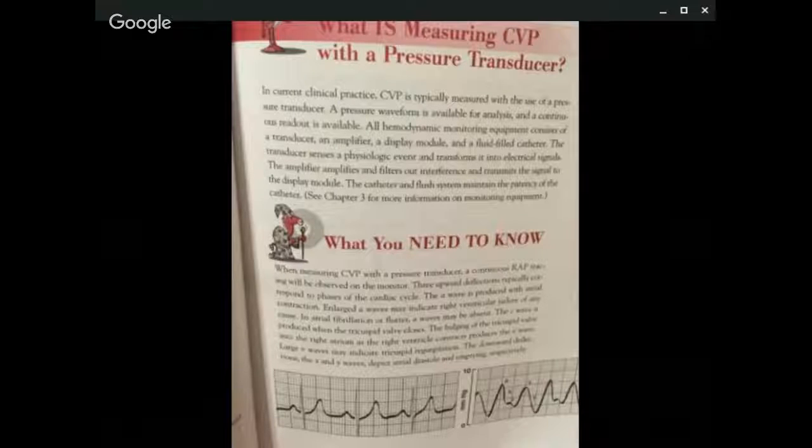So a good question to remember: what produces the V wave? The bulging of the tricuspid valve into the right atrium as the right ventricle contracts. Large V waves may indicate tricuspid regurgitation.